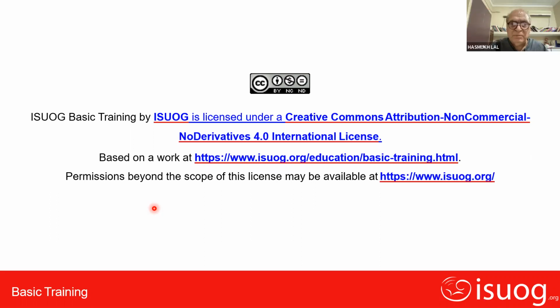So now it is question number 7, is it? Yes, sir. So most common lung anomaly, and Rama had already told about CPAM, the congenital pulmonary airway malformation, a cystic lesion, microcystic, macrocystic. This is the commonest of the lung anomalies actually. So I think 83% are correct. The pre to post orientation improvement is from 68% to 83%. Yeah, great.